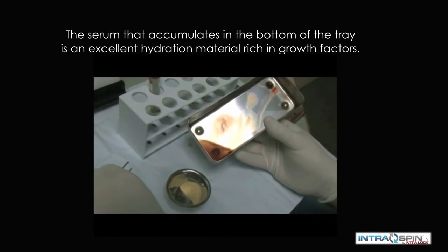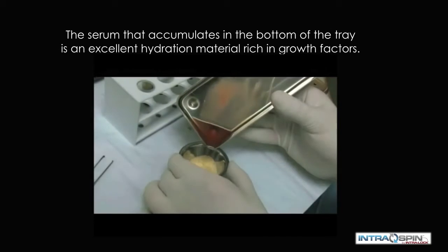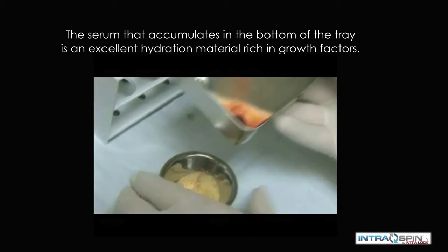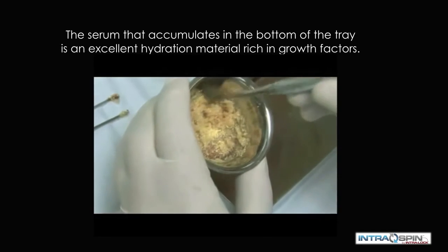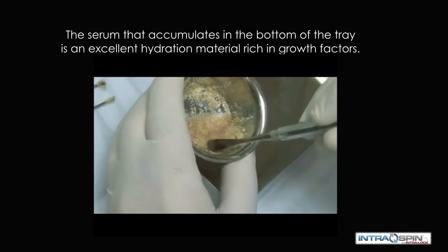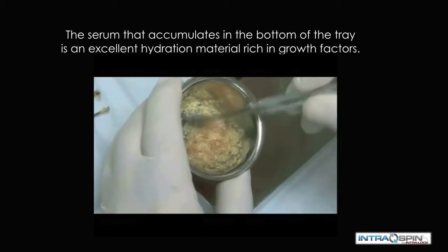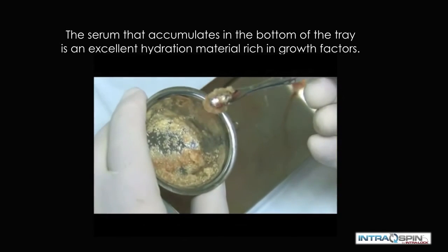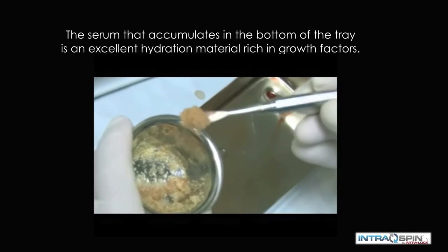There may be times, however, that we need to employ a biomaterial. We can use the serum that is collected at the bottom of the collection tray to hydrate the bone graft material. In this way, we make the bone graft more bioactive and improve the handling characteristics. Note the adhesion of the bone graft material to the spatula.